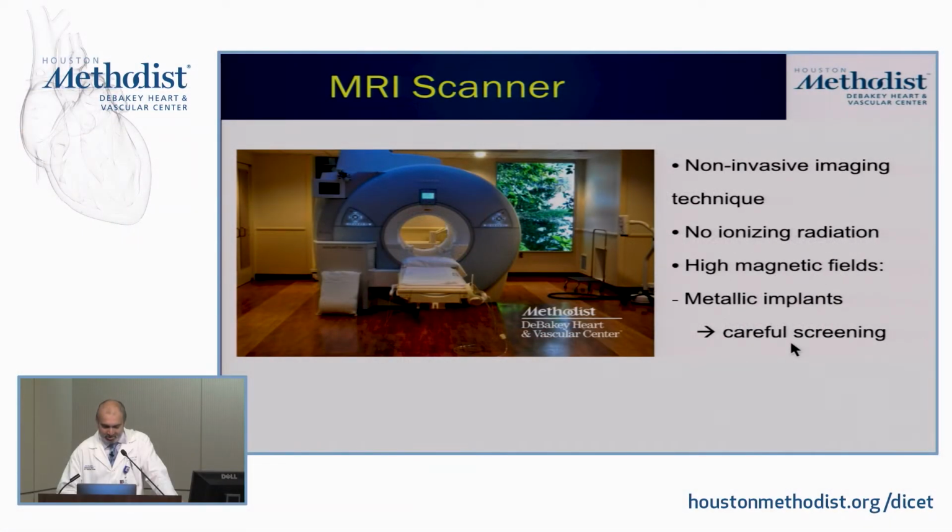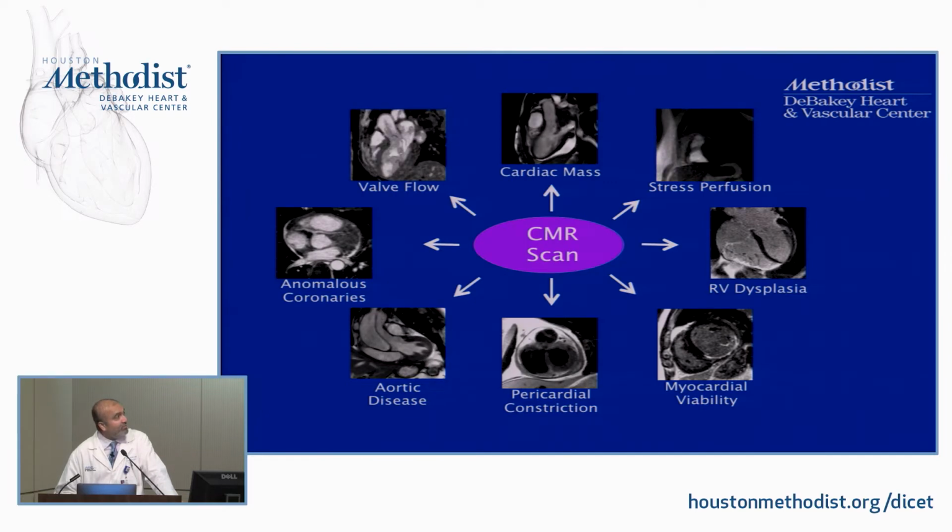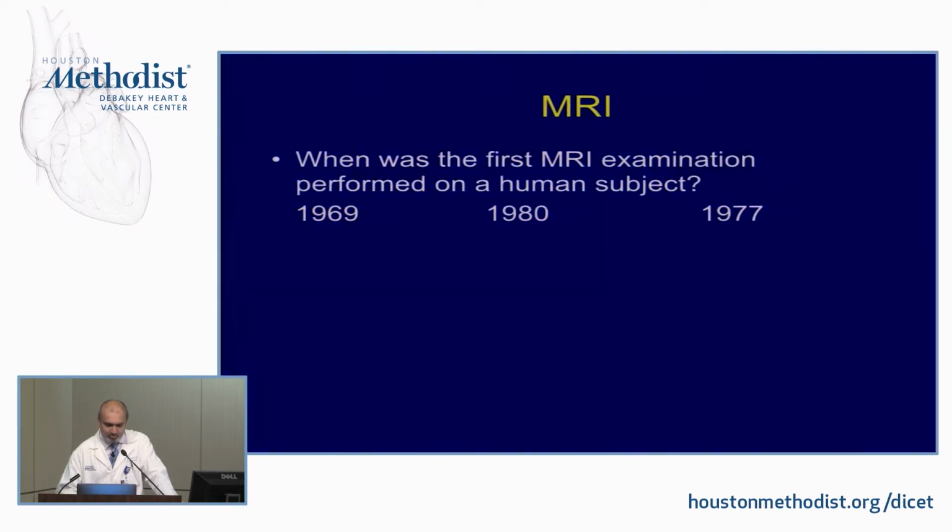Now, the end result is all of these different images here. I think what this slide tries to show is the power of the CMR technique, with the ability to do a variety of different types of imaging of the heart. Over the course of this academic year, we're going to go through a lot of these different indications and talk about how CMR is utilized to achieve images to help us take care of patients with this variety of different cardiac disorders. But let's go back in time in our time machine here.